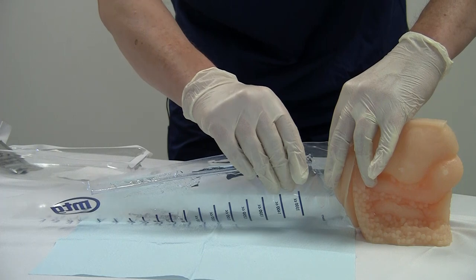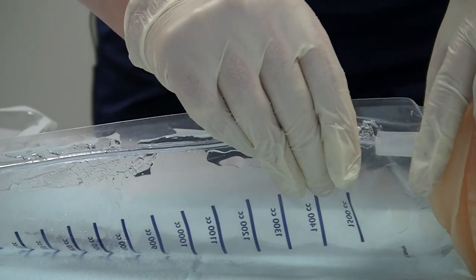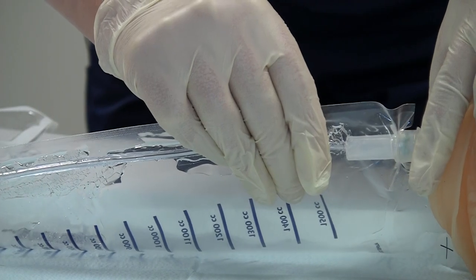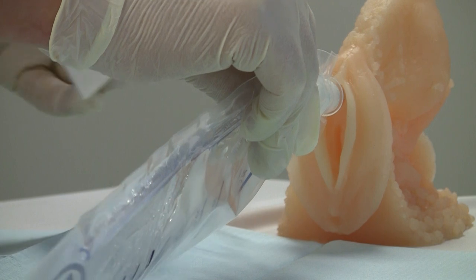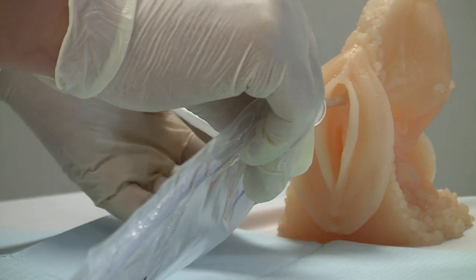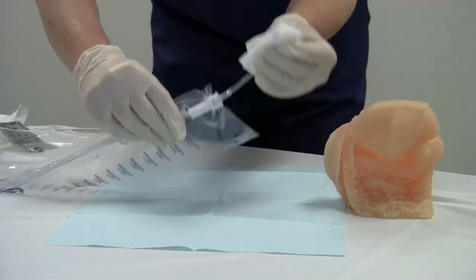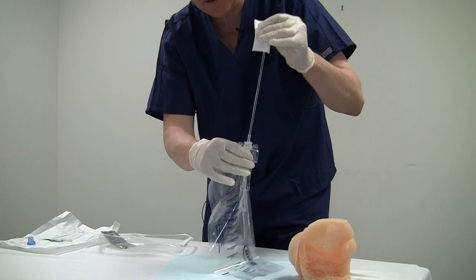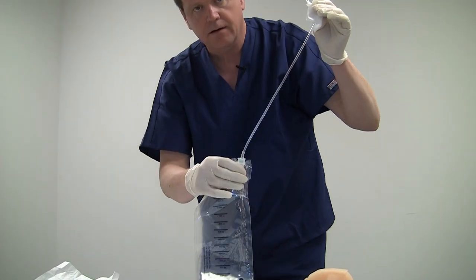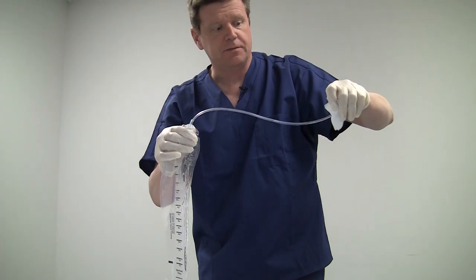Once she discontinues voiding, hold the catheter just like we did in the male example, and pull the catheter out about 1 inch and see if we have any more fluid. Reach back into the kit and get that gauze tissue. And as the catheter leaves the body, use that gauze tissue to catch the eyes so we don't have any spilling. Clamp the eyes off. Extend the catheter all the way to the end. Measure and record output. We need a sterile sample, just as before.